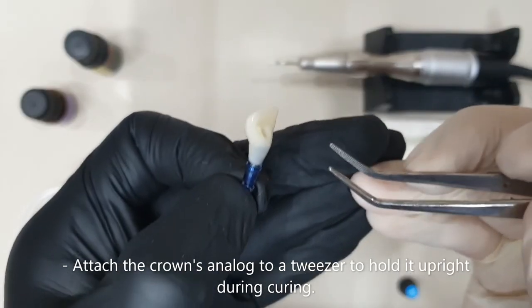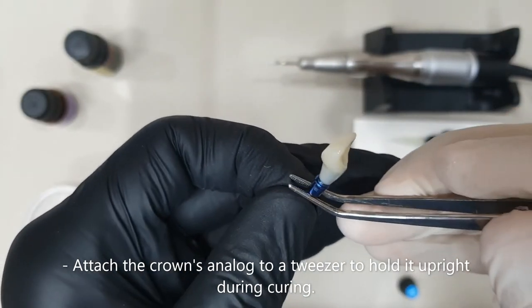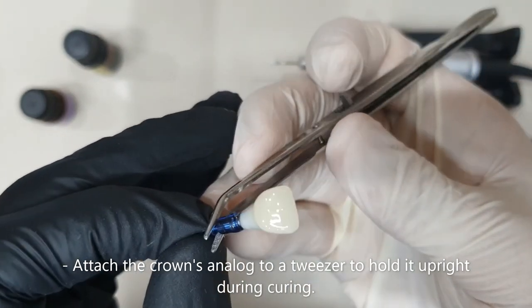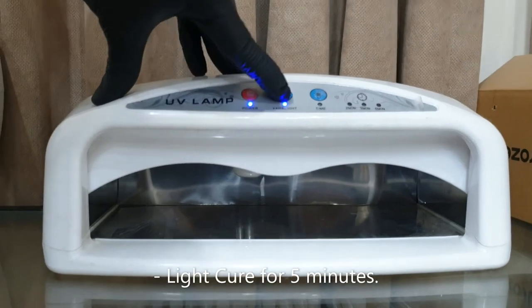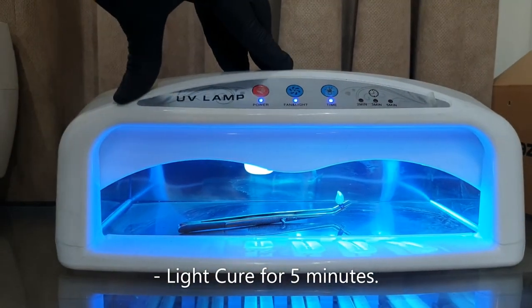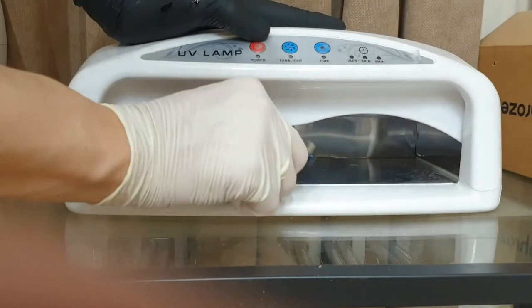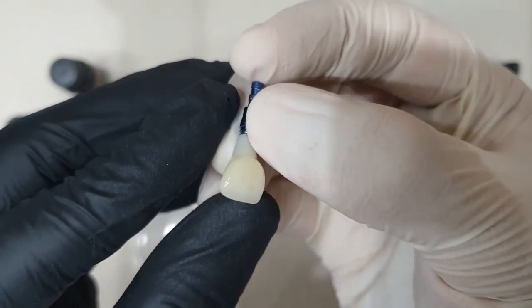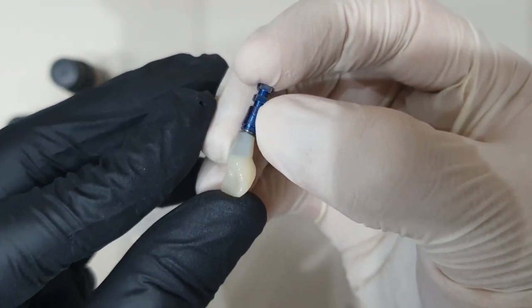Now I'll go ahead and attach this to a tweezer and put this inside of my light curing box. And this is our final product.